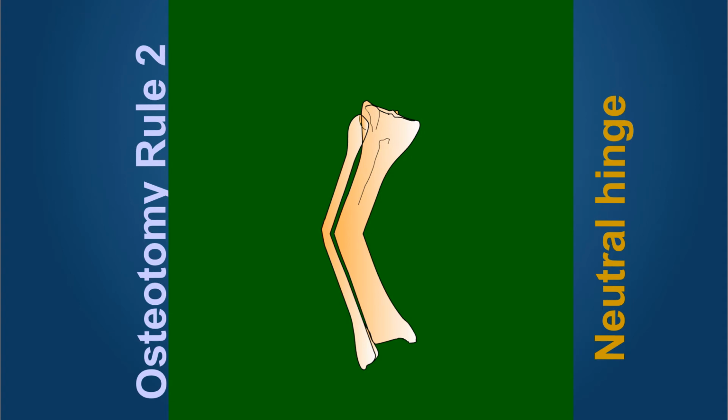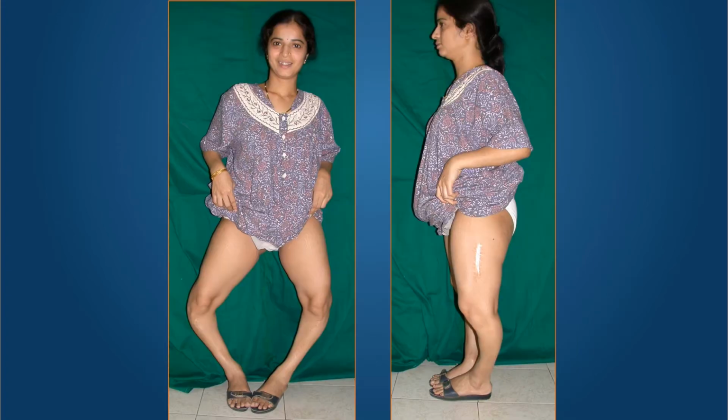So let's now come to rule 2, in which we often find ourselves in situations where we cannot perform the osteotomy exactly at the apex of the deformity. If we place the hinge at the CORA or the axis of correction, but the osteotomy at a different level, we will still get a correction which is very accurate, but it is accompanied by a minor translation at the level of the osteotomy, and the overall axis lines up. Typically used in juxta-articular deformities and in the majority of cases in clinical practice.